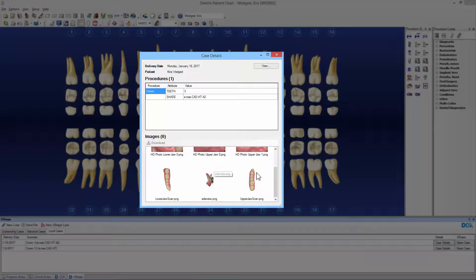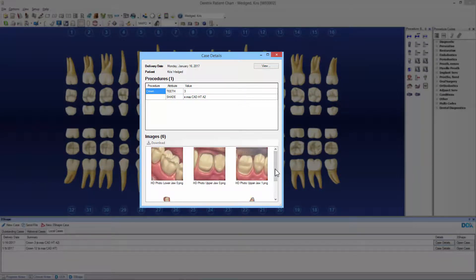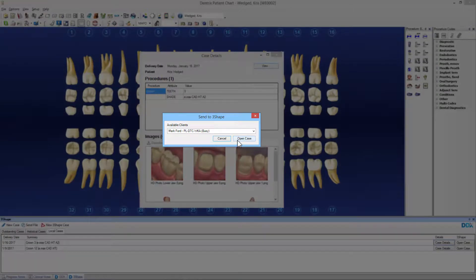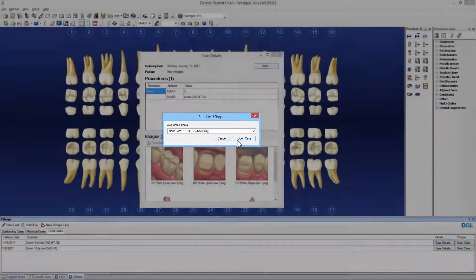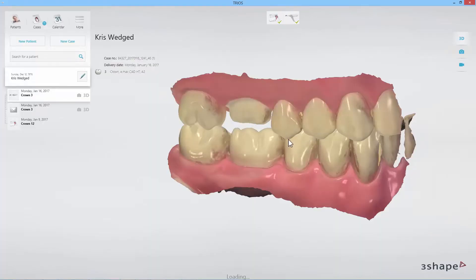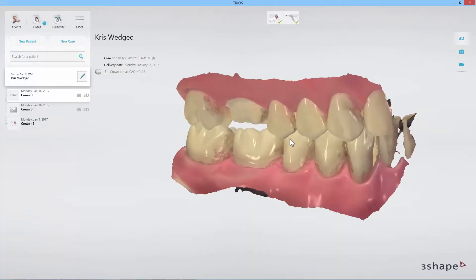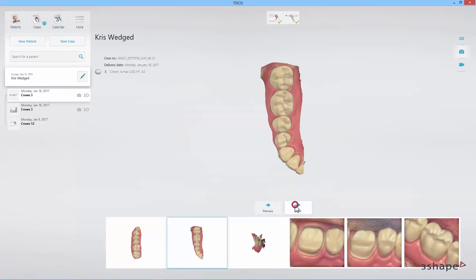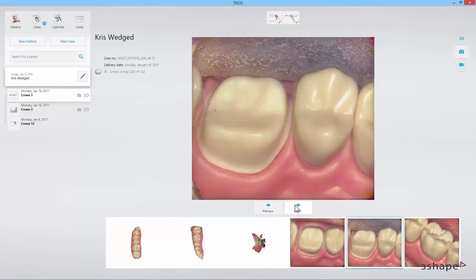You will now be able to see the detailed order information transferred from TRIOS and thumbnails of the scans. If you wish to view the case, click the View button. You can decide whether you wish to view the scans on the PC that you are working on or on any other PC in your local network. Click the Open Case button. You will now be able to view the scans in TRIOS. The integration allows you to view the scans on any PC in the network whenever you want and it provides a great overview of your patient's TRIOS cases.